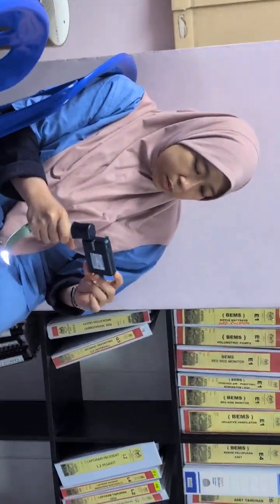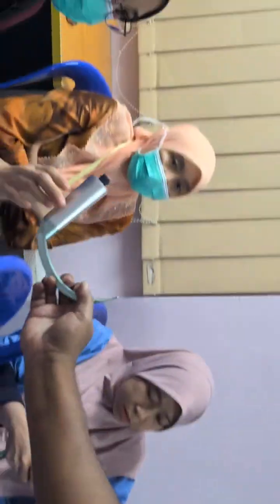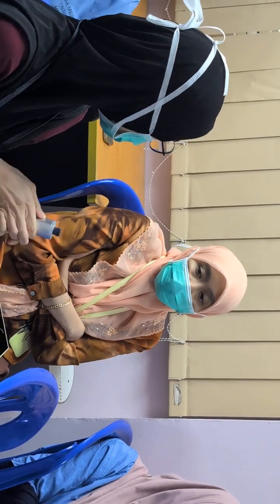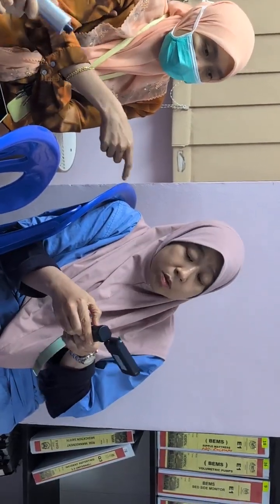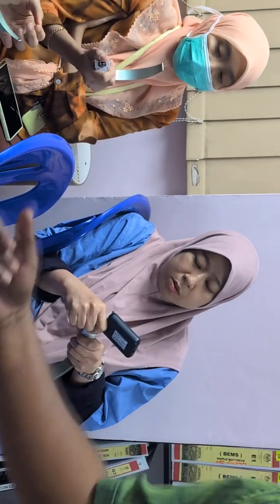You guys interested in the Miller Zero? Who wants to see the Miller Zero? This is a D, I believe so. This is a mana? Satu. This is a 1.